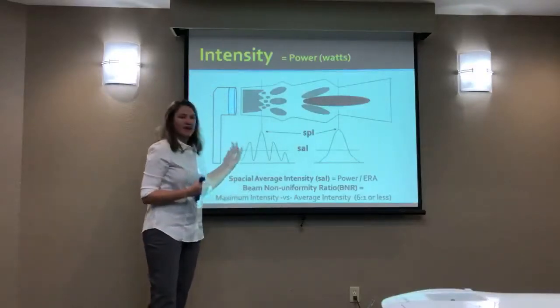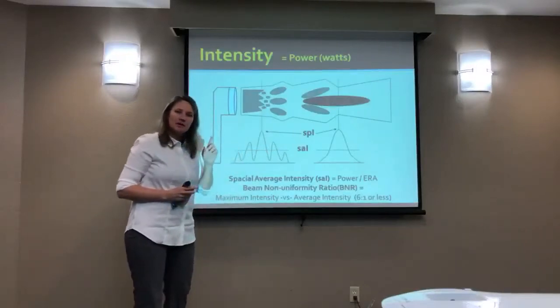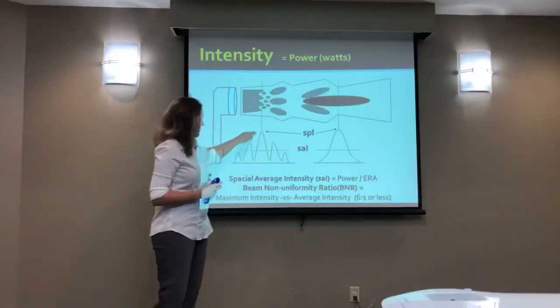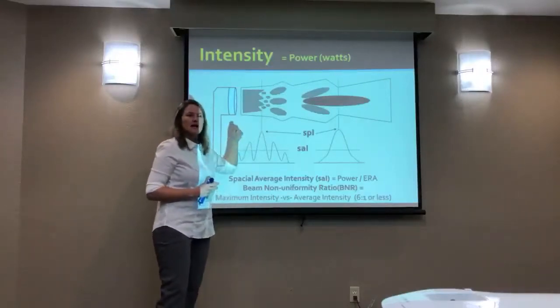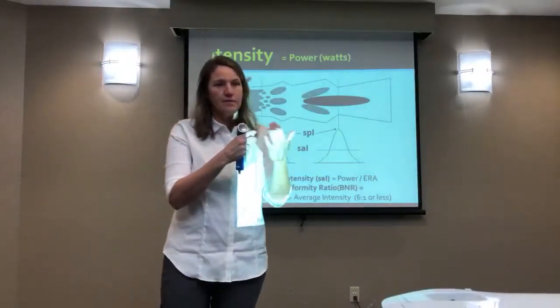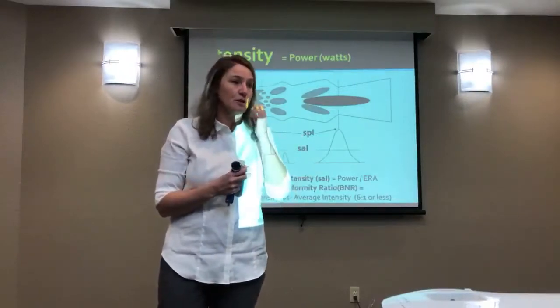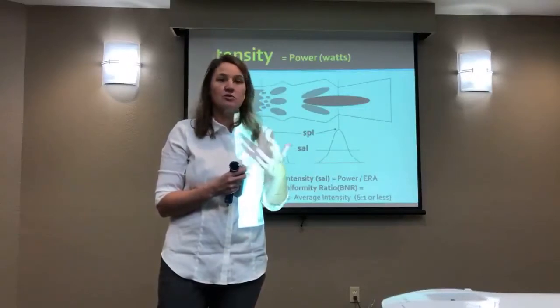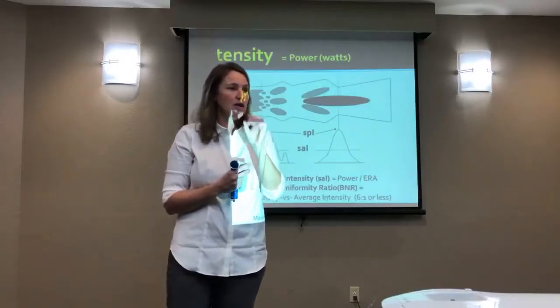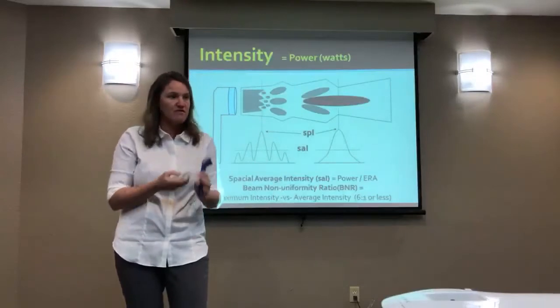So let's say that it was 5 to 1. That means if I'm delivering 1 watt per centimeter squared, somewhere in the beam it's 5 times hotter. I'm delivering 5 watts per centimeter squared. So the peak is going to be significantly hotter. Again, when you understand that the energy is non-uniform and the center of the field is going to get hotter, it's going to help you do safer treatments, especially if you're on the aggressive side and using thermal levels, knowing that certain places have the potential to get more heated. So you definitely want to center your head over the site that you're really trying to focus the energy on.